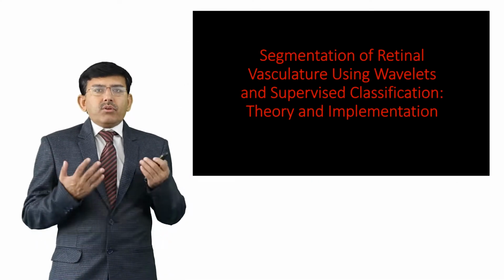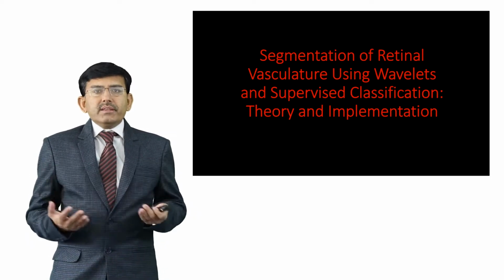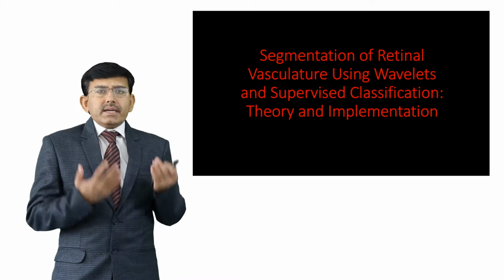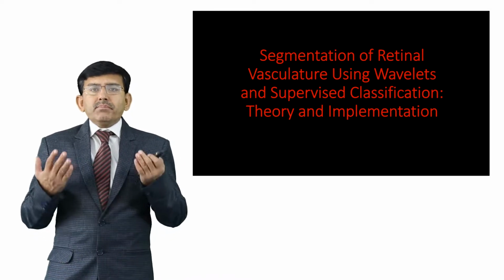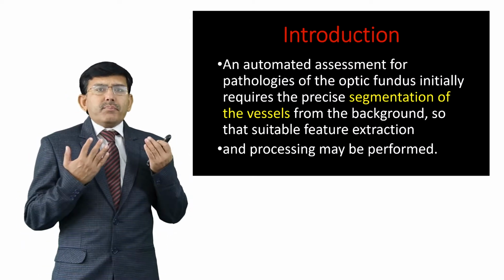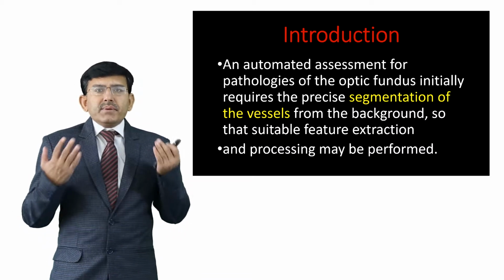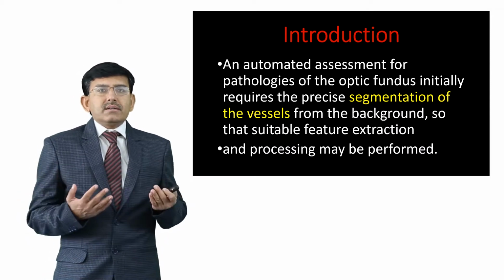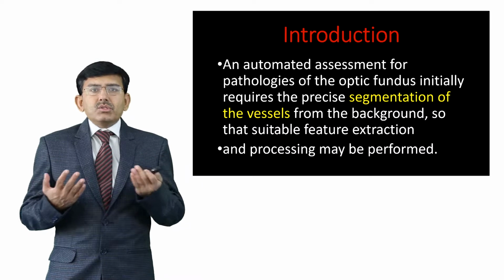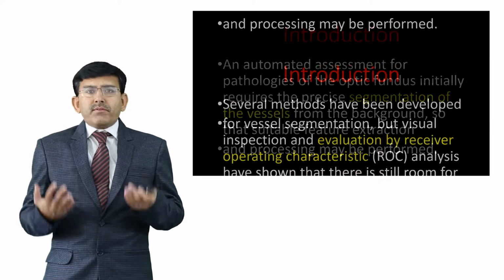Biomedical Image Processing course. Today in this module we will see segmentation of retinal vasculature using wavelets and supervised classification. During this module we will focus on the theory as well as the implementation part of wavelets. Automated assessment for pathologies of the optic fundus initially requires the precise segmentation of the vessels from the background, so that suitable feature extraction and processing may be performed.